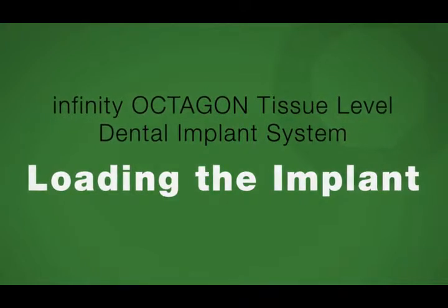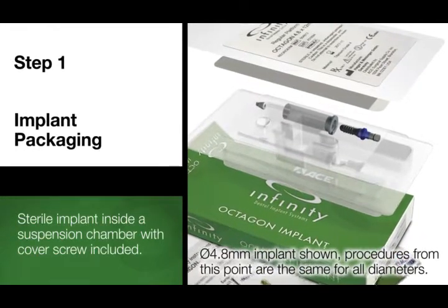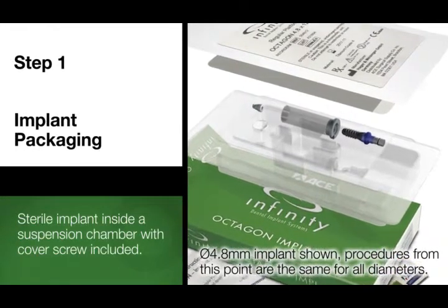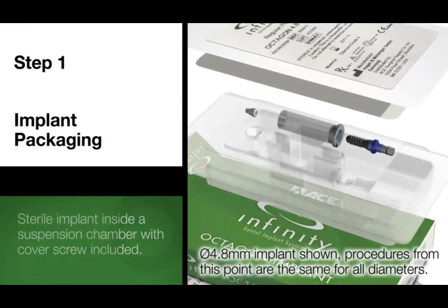Loading Infinity OCTAGON tissue level dental implants. Step 1. The implant package you have received contains a sterile implant with an implant suspension chamber and a cover screw stored separately just below.